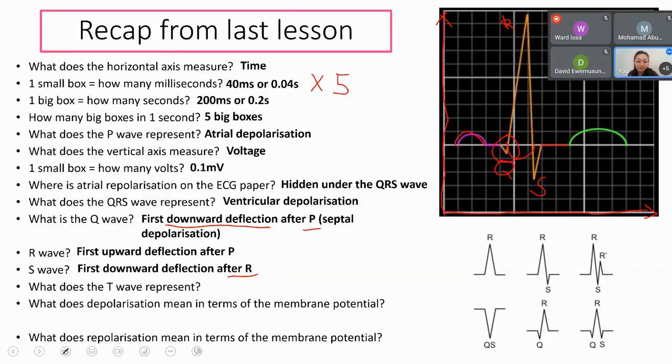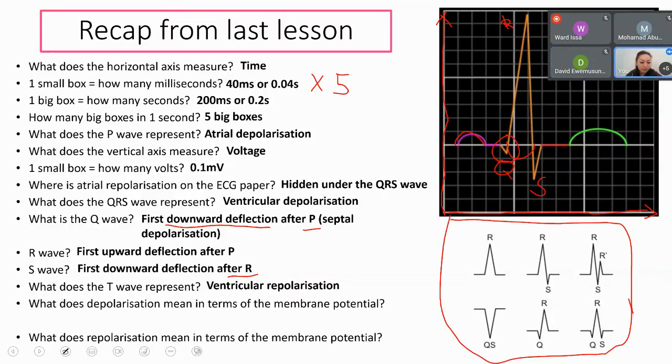Okay? And what does the T wave represent? Repolarization of which the ventricles? Okay, ventricular repolarization.